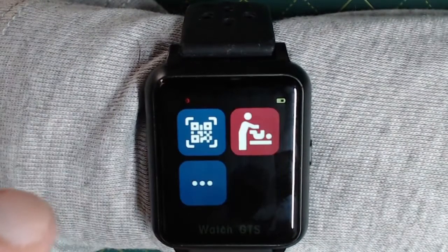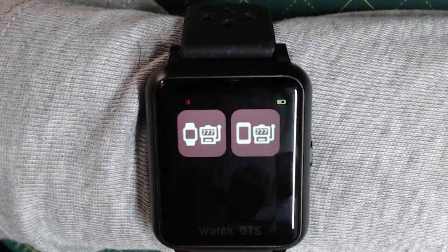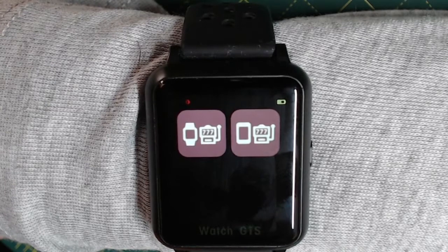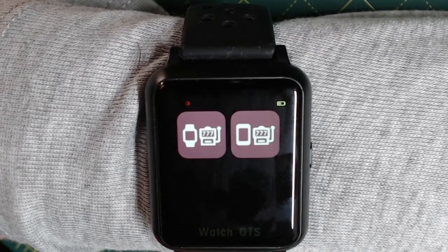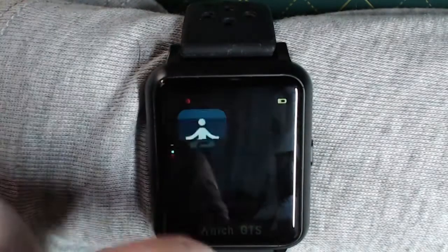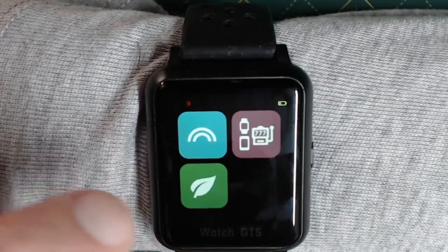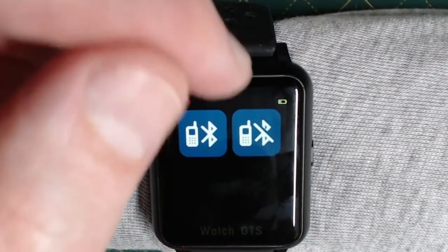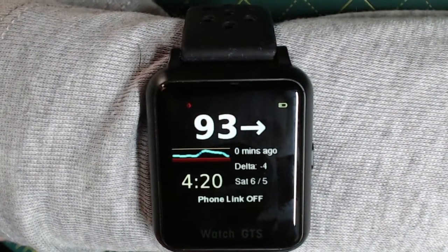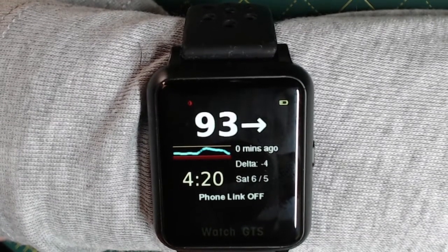In the 'more' section you've got three different features. The one on the top right controls which transmitter slot the Xtrip Core uses. On the left-hand side you've got the standard watch or other device slot being used; the button on the right-hand side would select the phone slot — the slot of the transmitter that's normally used with a phone. You'd only want to set that if you were not using a phone at all and wanted the watch to use the phone slot instead. You can also turn Bluetooth — which connects to the phone — on or off. Let's turn it off. Now you can see it says 'phone link off.' In this state there's no way the watch can talk to the phone at all, so only switch that off if you were using it completely standalone and not using it with the Xstrip app.